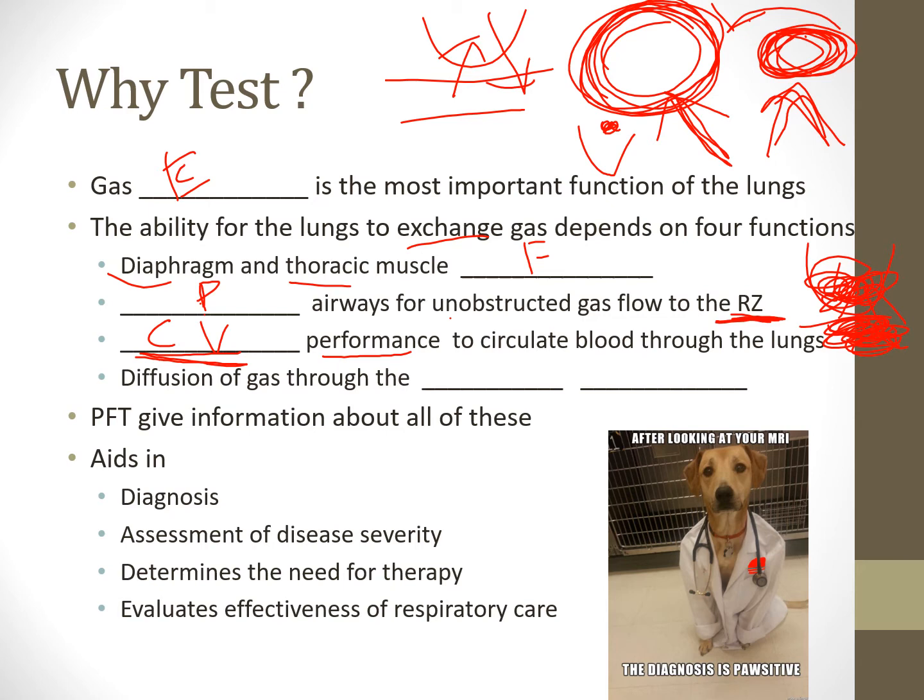Believe it or not, the pulmonary function test can actually look at both how bad they're wheezing, or their restrictive effect, as well as their obstructive effect, right? So this can actually give us quantifiable data. Now, are we going to do it on a patient that can't breathe, that's on a lot of oxygen? No, but we can do this outpatient. If we have someone that has steady congestive heart failure, right? It's under control. They're coming into the pulmonary function lab. We can actually look at the compliance and resistance of the lungs and quantify how much it's affecting the lungs. It's pretty interesting.